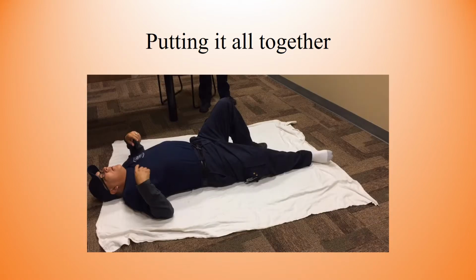So now we're going to put it all together. Now please keep in mind with this demonstration video that this is basically showing you how to apply the leg traction splint. In this simulation, it is assumed that all other patient care is taken care of or will be. I won't actually be cutting off my coworker's pant leg, but just an idea of how to apply the leg traction splint. That's what this video is going to show.